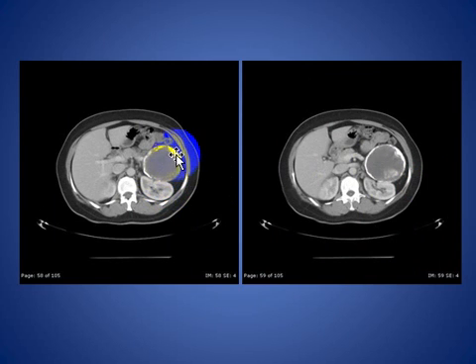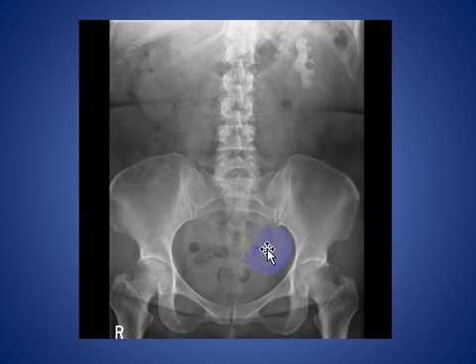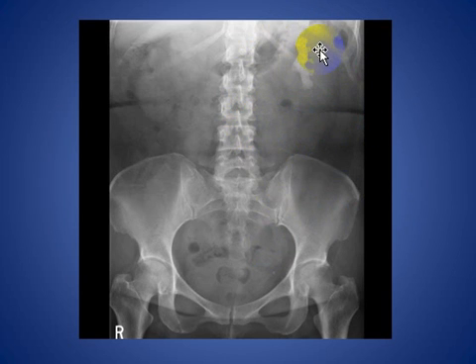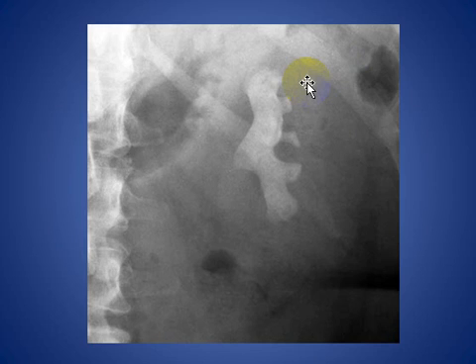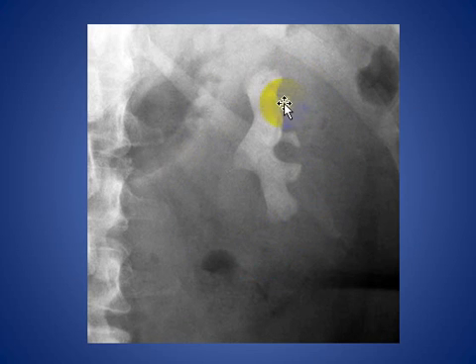Here you see calcification in a cyst outside the kidney. This is a calcified hydatid cyst. Here you see an abdomen X-ray in a female patient with a large stone involving the left kidney, called a staghorn calculus. This is a magnified view of the staghorn calculus involving the left kidney.